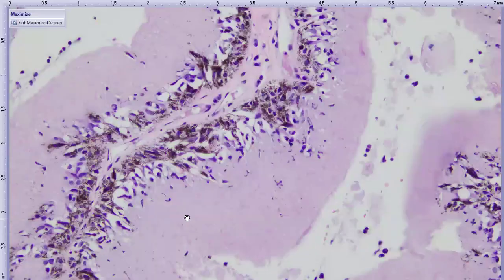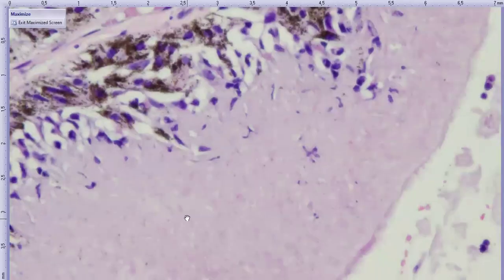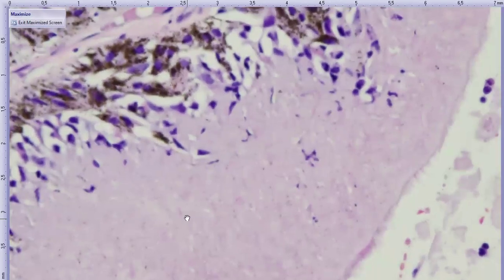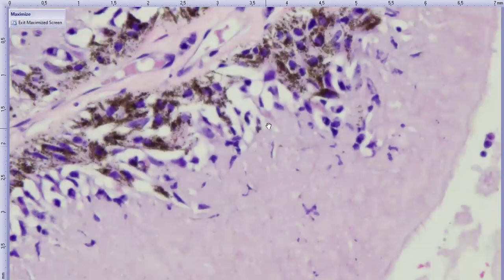So this is extracellular, finely fibrillar, eosinophilic material, pretty tightly adhered to the ciliary body surface. And this is amyloid. So we have a really thick amyloid carpet along the ciliary body surface. And then if we look right next door, the ciliary body epithelium is a little bit distorted, maybe hyperplastic. But the non-pigmented layer is on the top, and then the pigmented layer just beneath that, like you would expect.